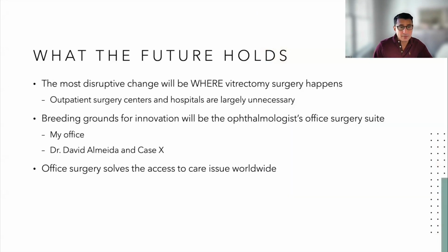And then this is just a personal thing that I wanted to touch on very quickly. I think one of the most disruptive technologies that the future holds for vitrectomy is where that surgery happens. And that's going to address a big cost issue and resource utilization issues. We don't have to be in the hospital. We don't need to be in the outpatient surgery centers. We can do this safely in the office.